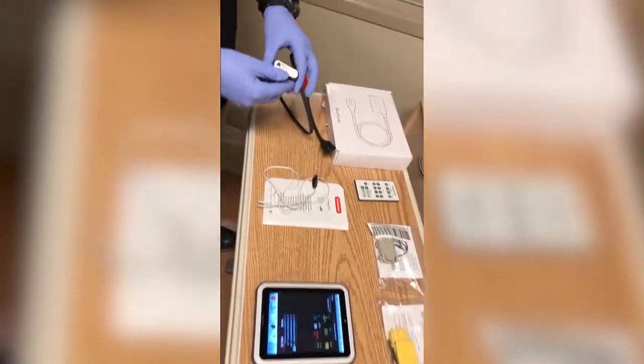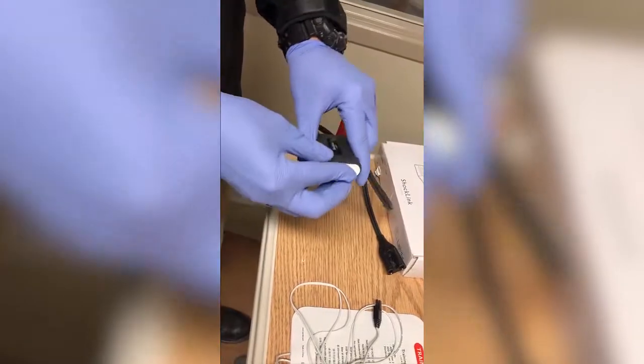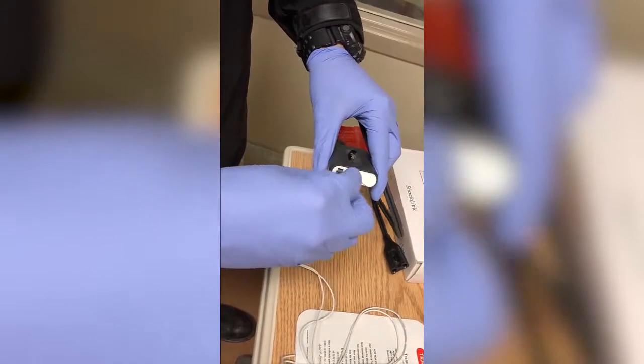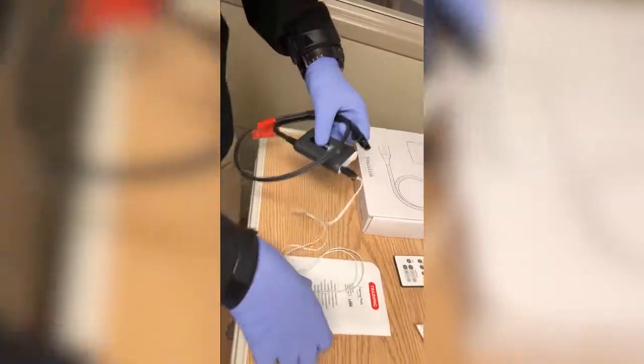At this point we're going to turn on the shock link system by opening the door and then closing it again. The power button is being indicated. It's looking for the training pads attached. Going to come over to the mannequin.